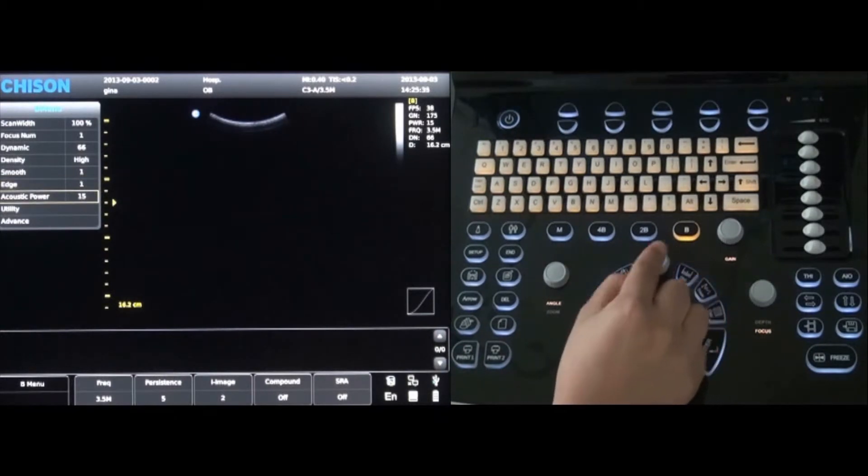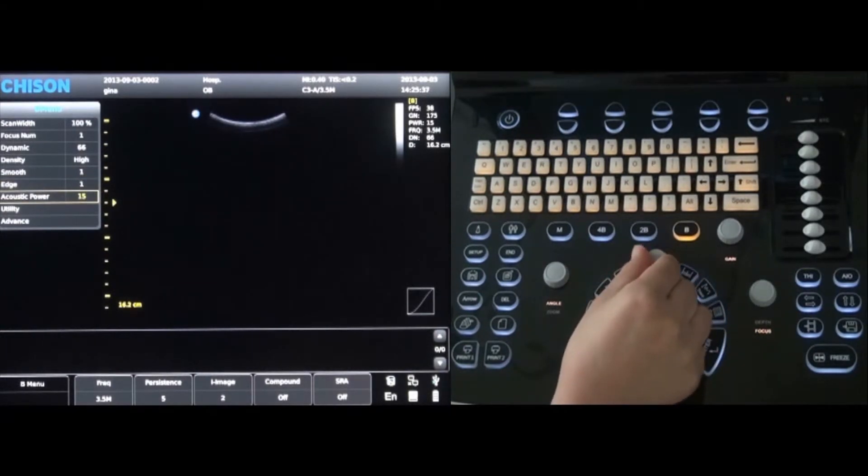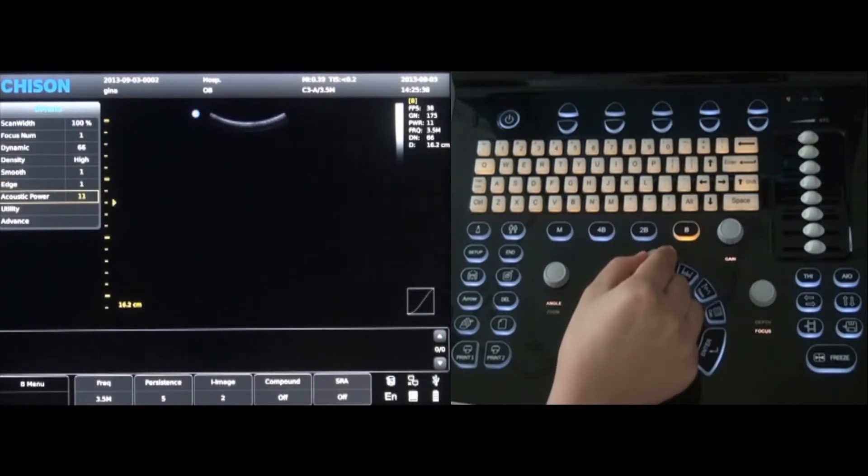The acoustic power is the final option. Select and rotate to the level needed.